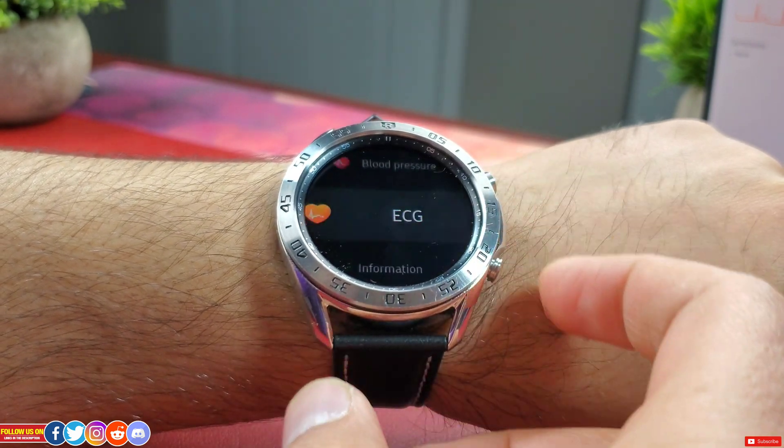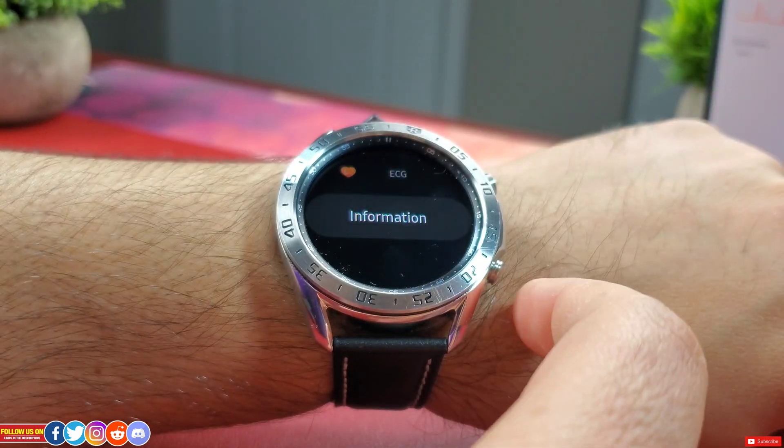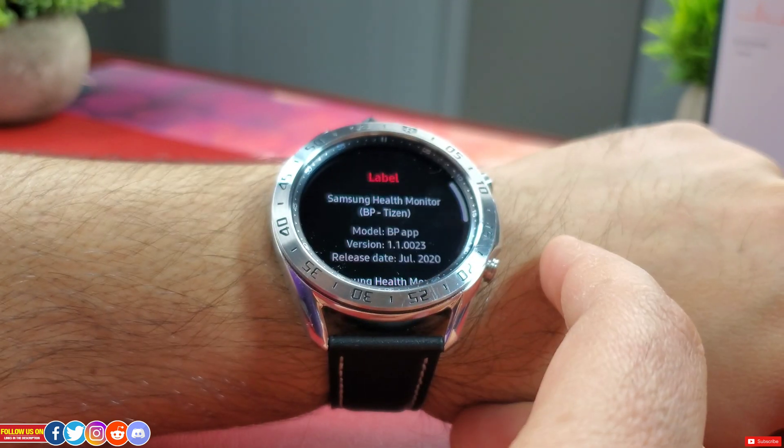Going back under ECG, you will find an information section which will show the app's version as well as the release date.